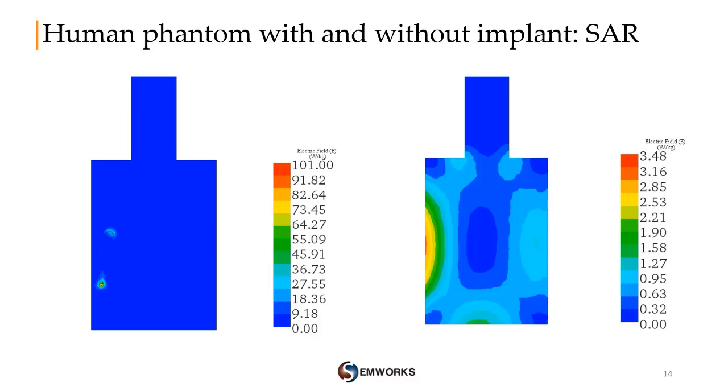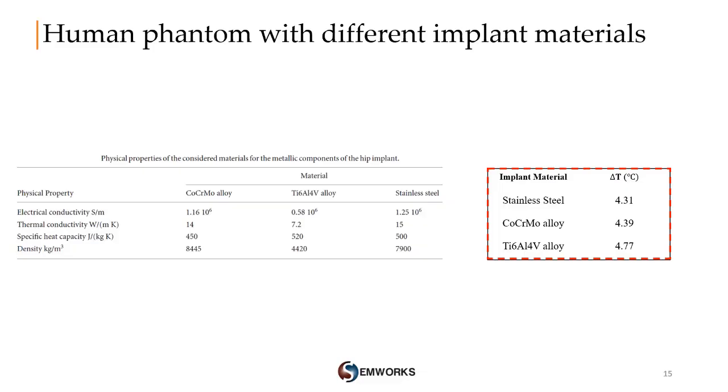We have 3.48 watts per kilogram for the human phantom without the implant and around 100 watts per kilogram for the human phantom with the implant, which is a very big difference, which explains the high increase in temperature around the implant device. Now we made a small test.